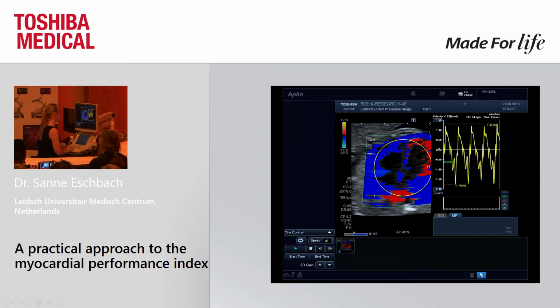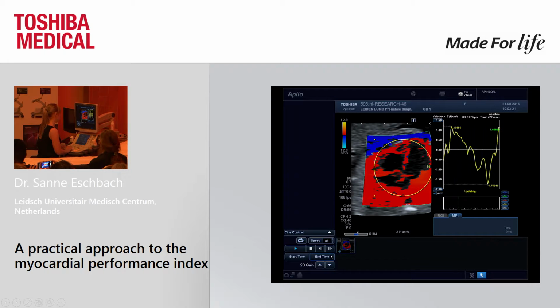Start time. This is the contraction time that you see, and here it's the 2-phase relaxation time. So here we can say end time. So now we have 1 cardiac cycle.